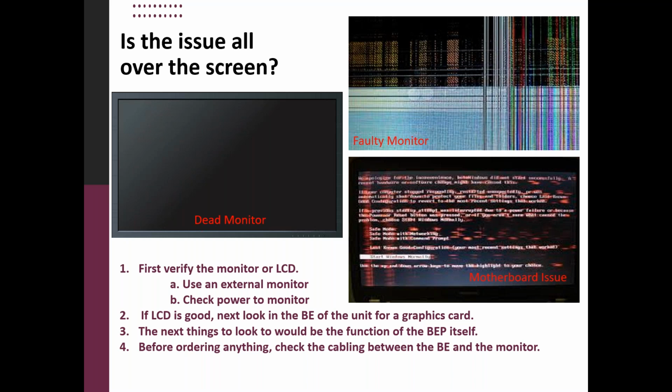You couldn't move from there. Although I will say, in this situation, before I replaced anything at the back end, I would check to make sure that my hard drive and my software were working correctly. A lot of times in the GE world, reloading software on a GE ultrasound unit is used as a troubleshooting tool because there's so much failure in their software.